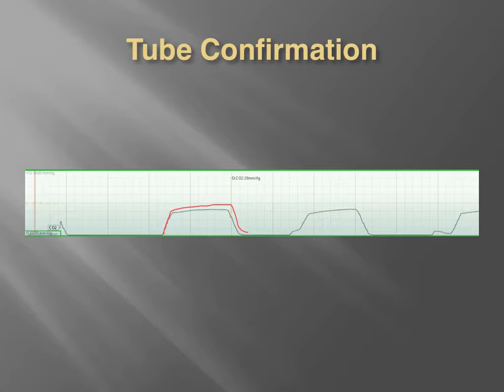Nice and square. Okay. And the level isn't too bad. You can see here it says 28 millimeters of mercury, so that's not too bad. And if I recall correctly, this was where we were performing CPR, so 28 millimeters of mercury while performing CPR is actually pretty darn good.